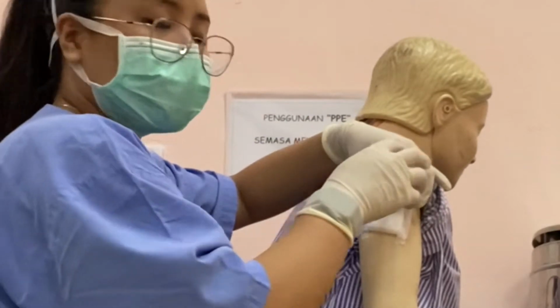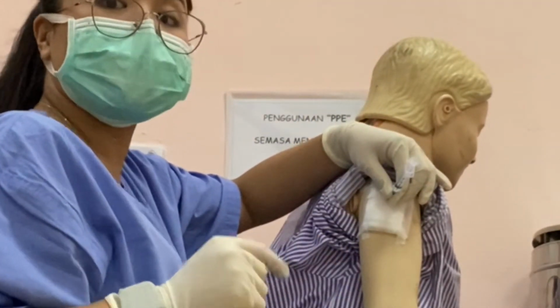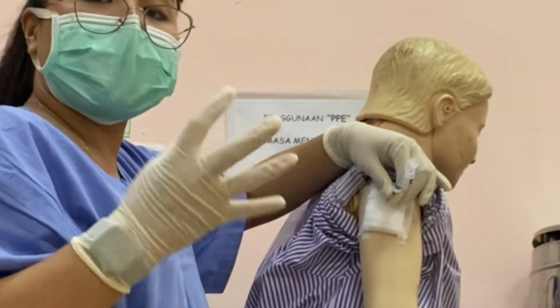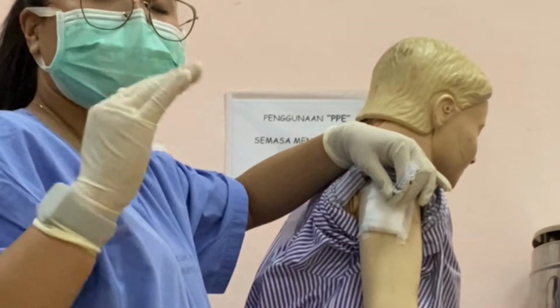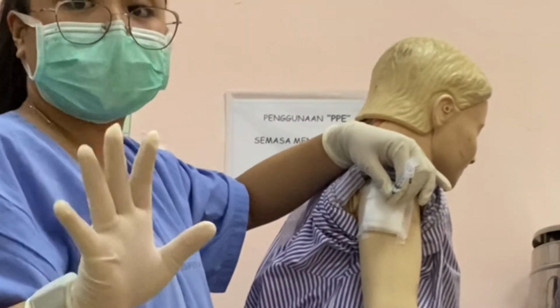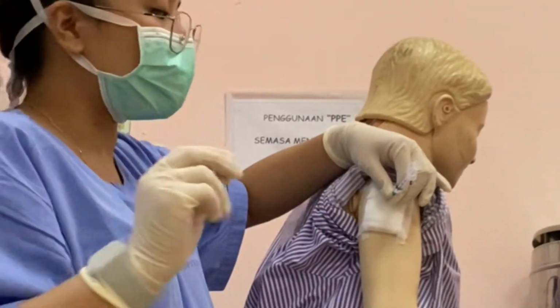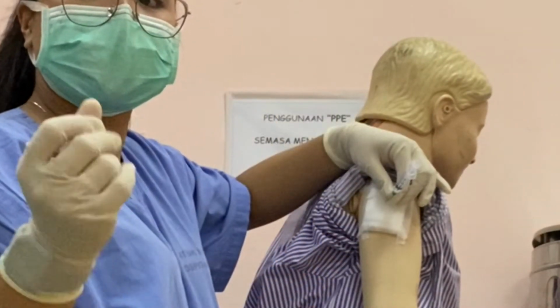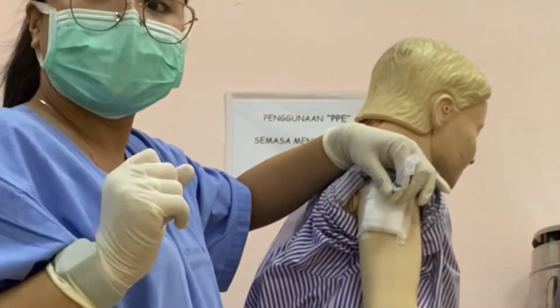After you poke, you must withdraw the plunger a little, because you want to know if there's a blood supply, or maybe the needle has poked an artery or a vein. So the medication cannot be given through that. So you have to pull the needle out if you can see blood inside the syringe.